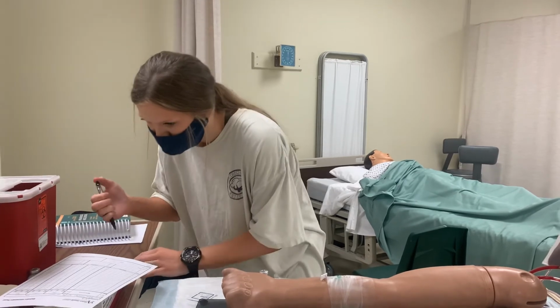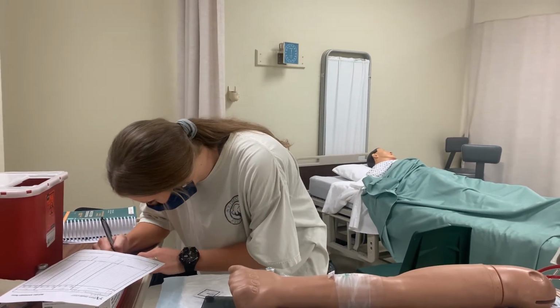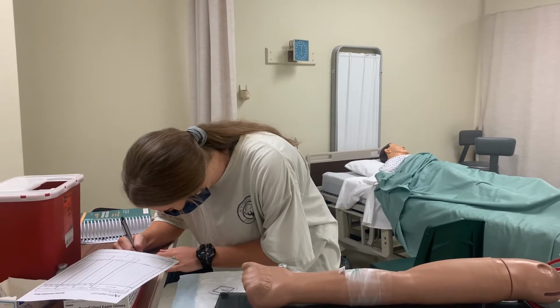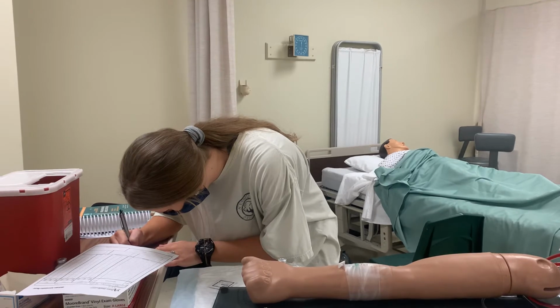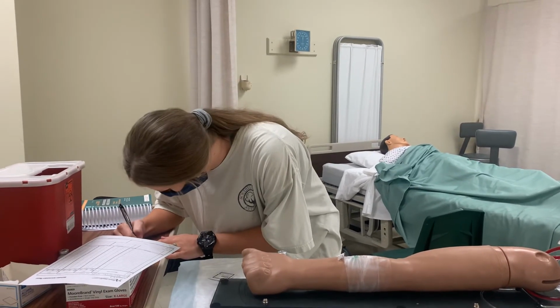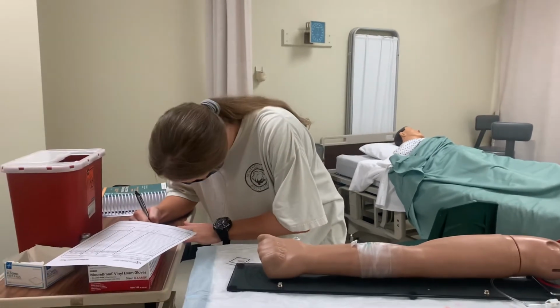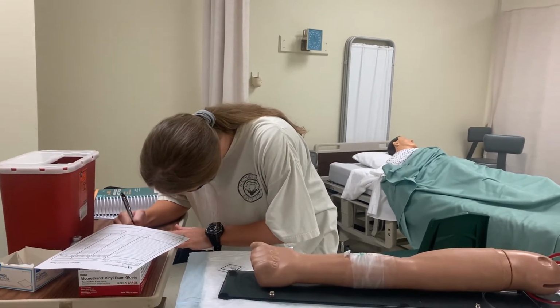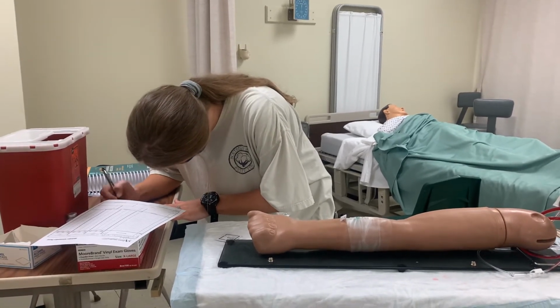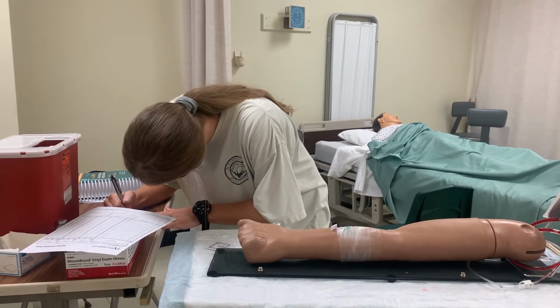So my patient is John Smith. I'm giving furosemide, 20 milligrams. Prepared on September 23rd at 10:35. Then the expiration date and the time that I'm going to be using it.